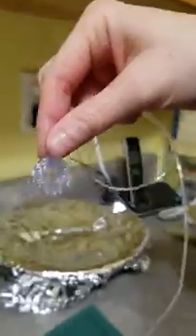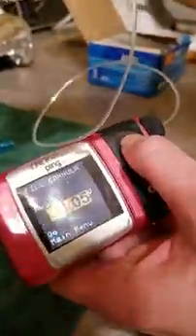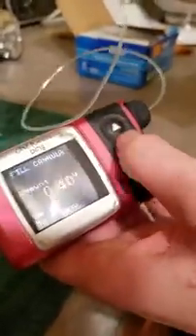I'm not really filling the cannula because I'm not changing her site. I'm just changing the insulin. So I go to fill cannula, and I'm going to put it on like 0.35. I'll put it on 0.40. Hope you can see this again. Focus this one. There's a drop, so that is working.